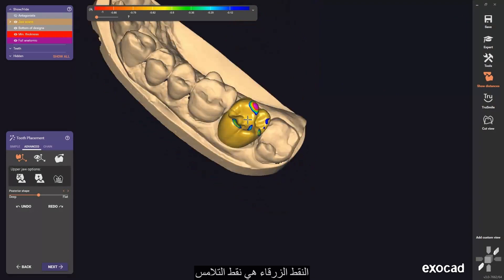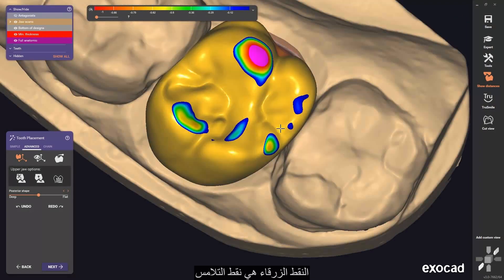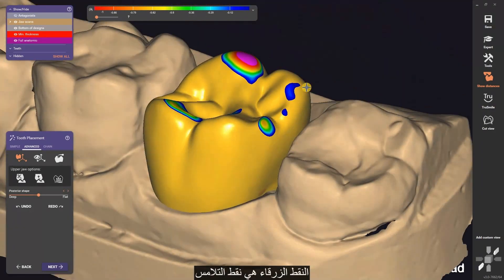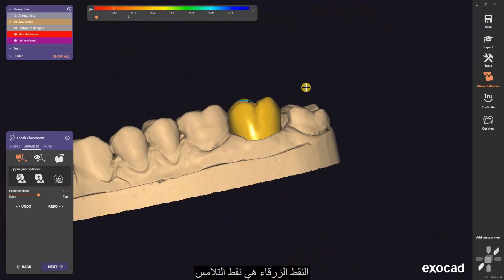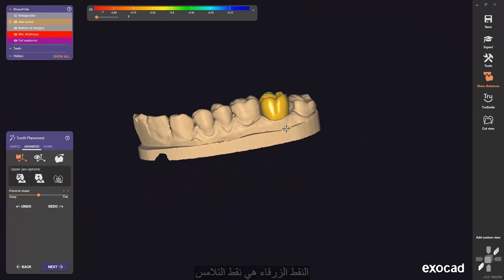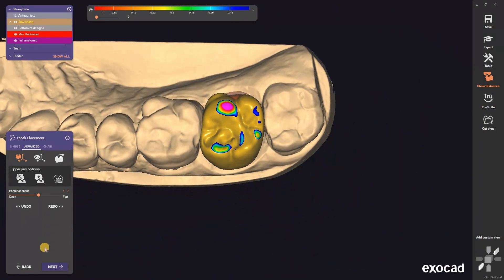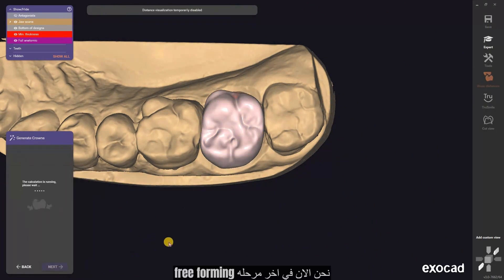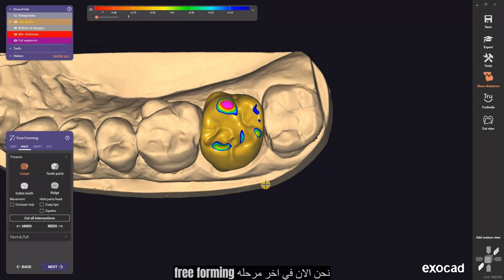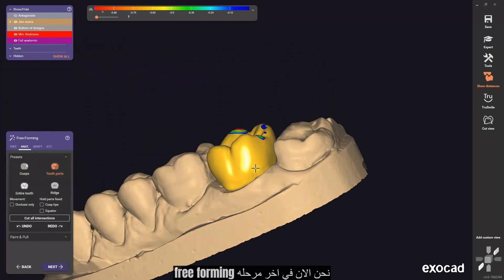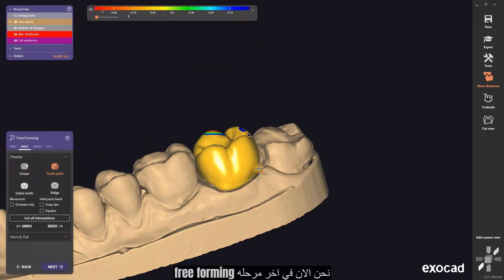The blue points are contact points. Now we are on the last part — free-forming the tooth.